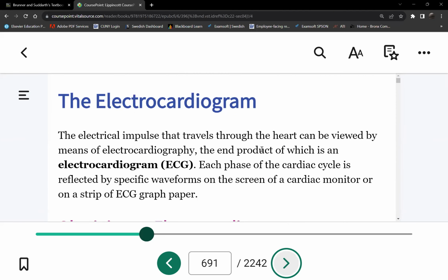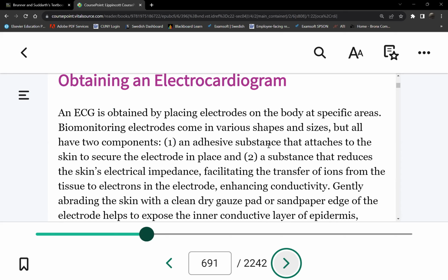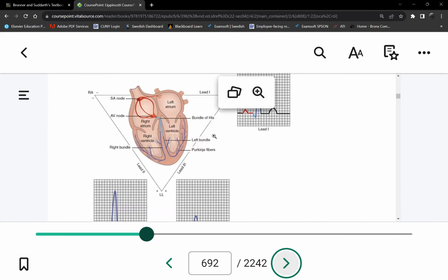ECG. The machine was invented by Dr. Einthoven long ago, and he demonstrated and illustrated it on an ECG paper. So on the next page, we will discuss how to measure and identify waves and complexes as shown on an ECG paper. What do those horizontal and vertical lines mean on the paper, right? Okay, let's start here.